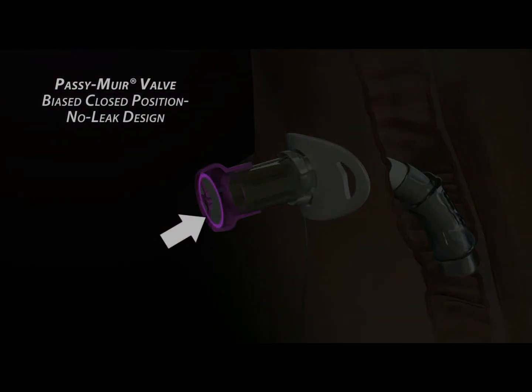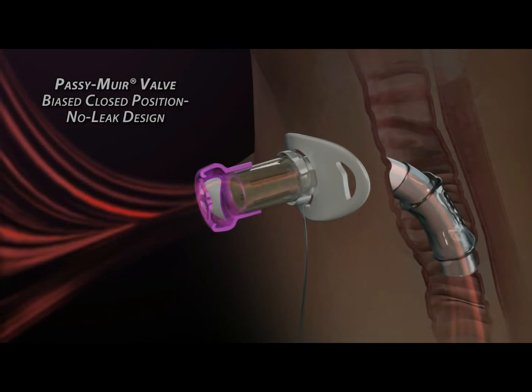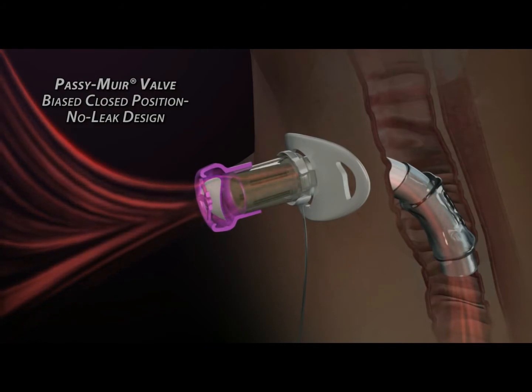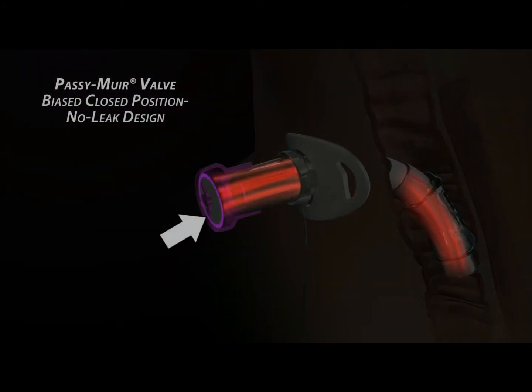The membrane's outer perimeter is forced to normally be in a state of compression against a lip inside the valve body. In a relaxed state, the valve is completely sealed, not requiring reversed airflow to close it. When inhalation begins, the membrane easily bends out of the way to allow air passage with minimal resistance. When the inhalation cycle reaches its peak, air stops flowing and the membrane instantly returns to its normal fully sealed position. This is the closed position no leak feature.